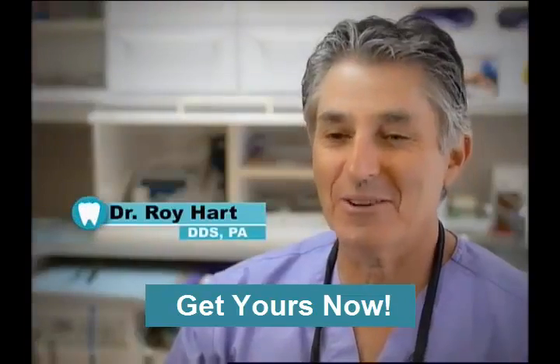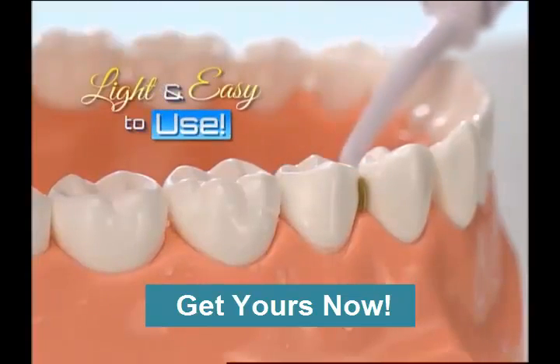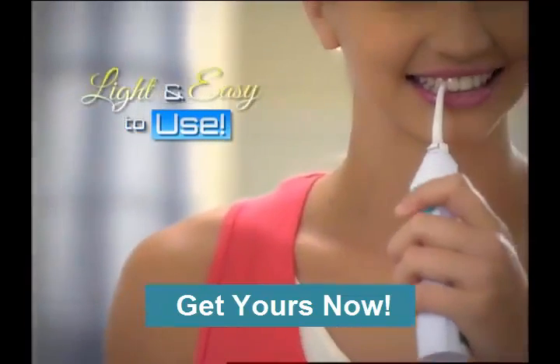The most important thing about flossing is actually doing it. The Power Floss is amazing. It's very light, very easy to use. You just put the water in the reservoir and just pump away.